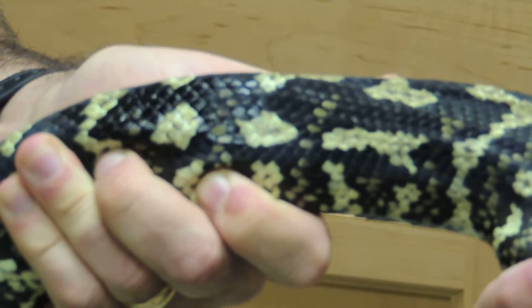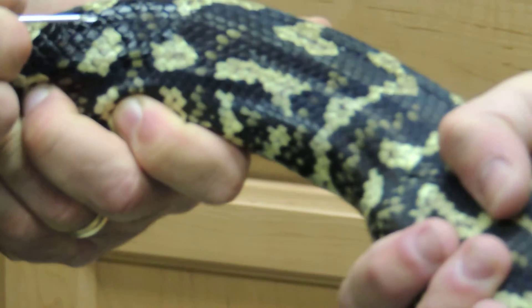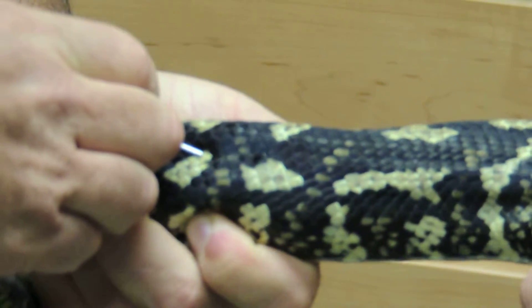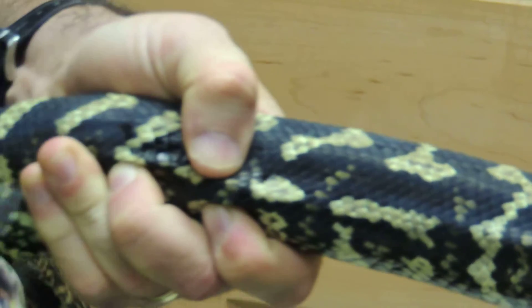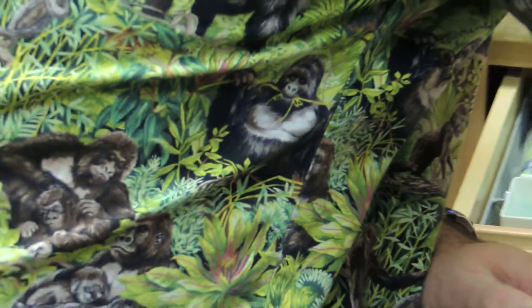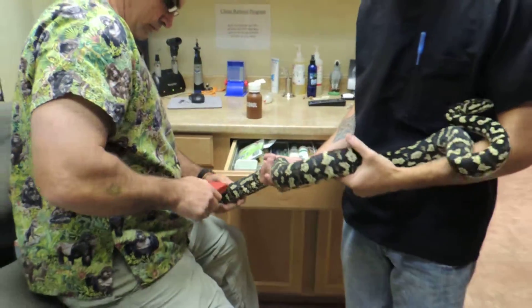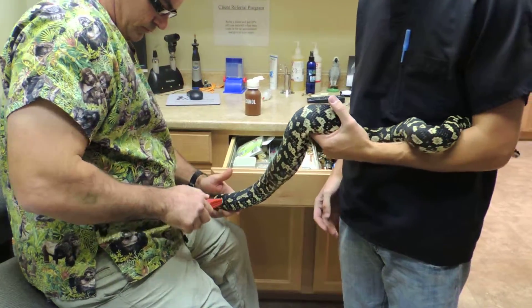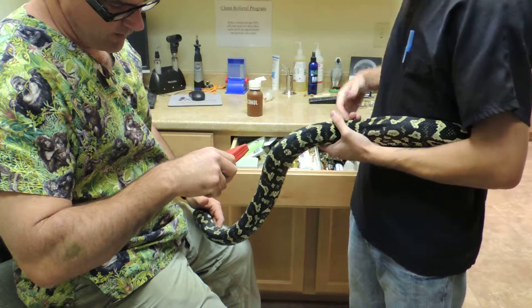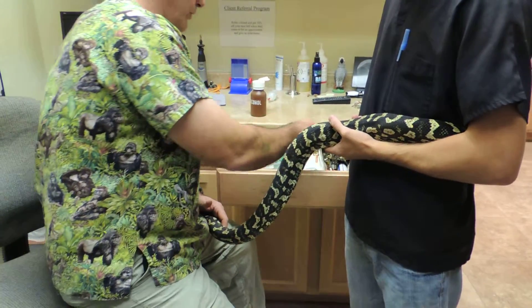So we have to go in between the scale rows, and then we can grab our scanner out. So we have it read: 0-A-02-143-1-1-4.